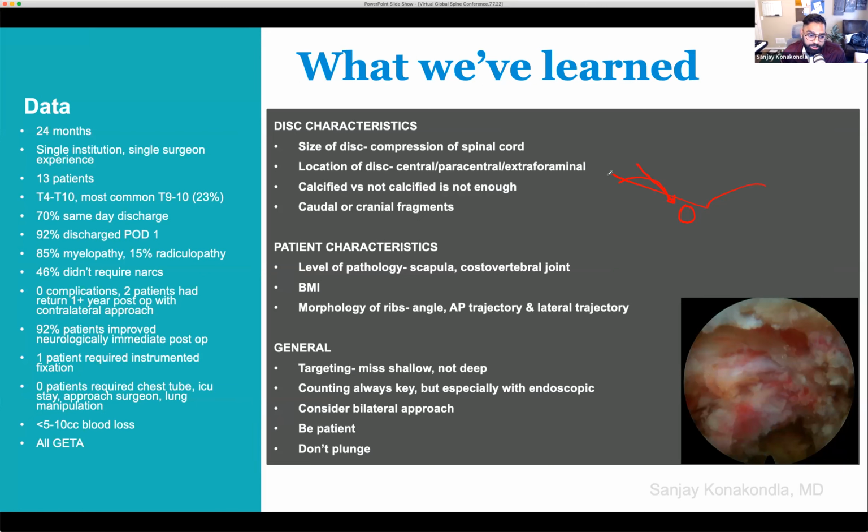So, you can miss shallow. You shouldn't miss deep, right? So if you're targeting with your needle, you want to make these errors, right? Anything here is fine, especially if you're taking your intraoperative fluoroscopy and you're not using intraoperative navigation. If you're too medial but superficial, this is good. It's fine. You're in muscle and you're against bone. But you never want to miss deep, because you're in some bad areas that you sometimes can have bad complications from.